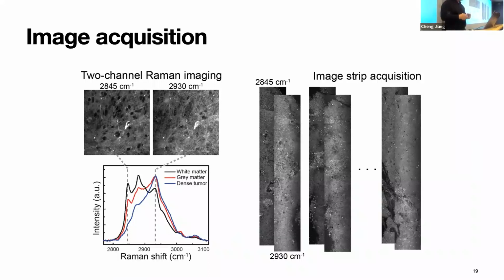SRH technology is based on Raman scattering. In Raman scattering, we have an incident photon on the tissue, and it can gain or lose energy when it is scattered. When it gains or loses energy, there is a shift in frequency, and we can measure this shift in frequency to characterize biochemical composition. But the problem with Raman scattering is that it is very slow to acquire broadband spectra.